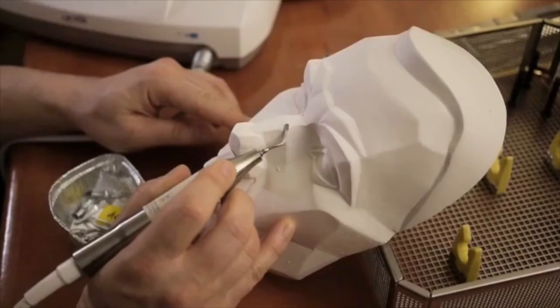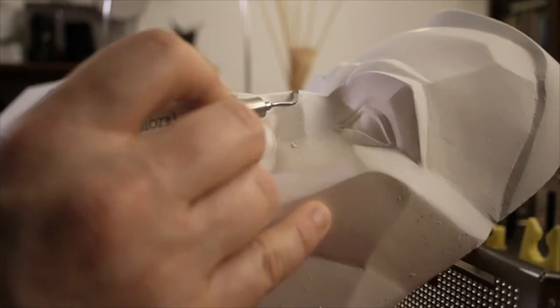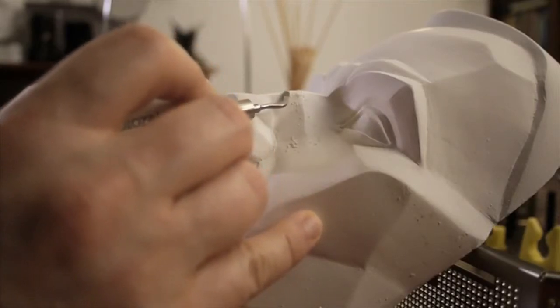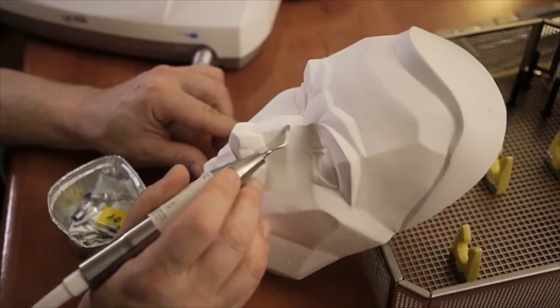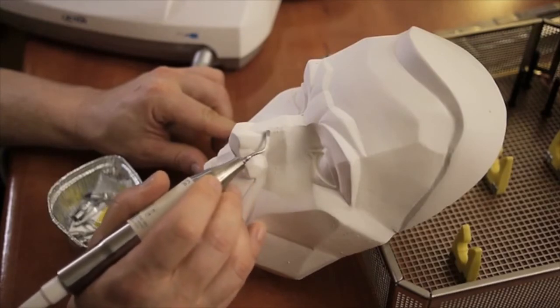We described in this article the way we perform hump reduction, osteotomies, bone smoothing, but also ultrasonic rhinosculpture, which is a new technique consisting of debulking the bones without breaking them. That means that when the bony vault is not too wide, incremental ostectomies can be performed to narrow the bony vault. The nose can be narrowed without breaking the bones.